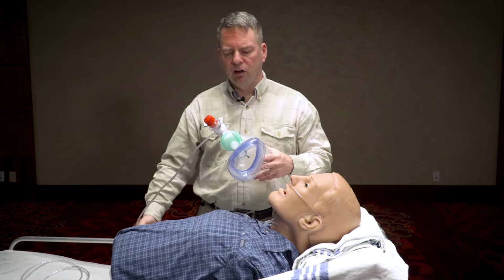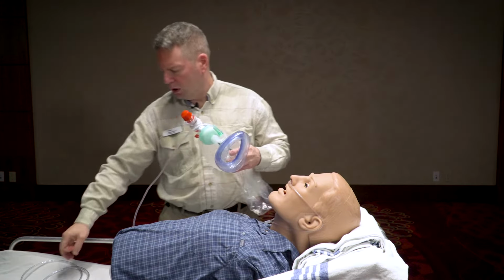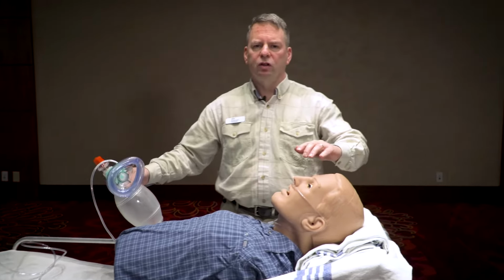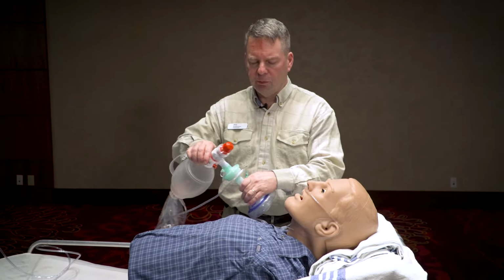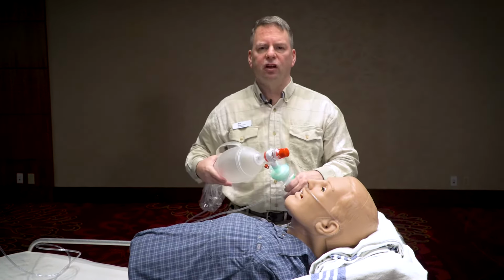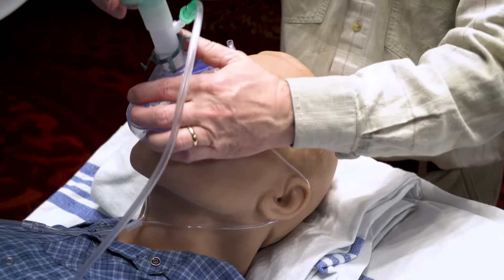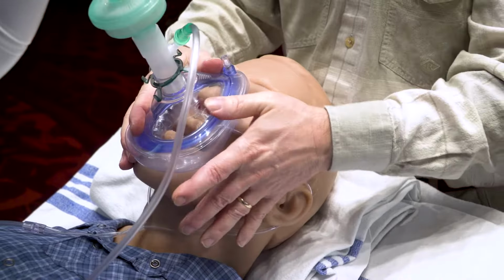But in this case, we're not going to do that. We only have the one oxygen source. So what I'm going to do is connect the oxygen from the nasal prongs and then turn the flow up. And if I turn it up to very high flow, the patient wouldn't tolerate this very well if they were conscious. But if in preparation for intubation, I wanted to do external CPAP, the high flow is flowing into the patient and the pressure is just being released into the room through his open mouth.